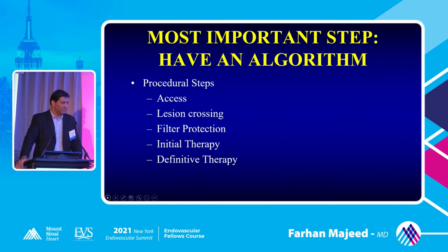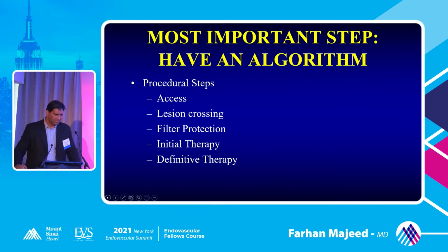So someone throw out what size sheath, how you're going to get up and over. Go ahead. Contralateral, good. Okay. Why 7, not 6? Okay. But okay, that's one.